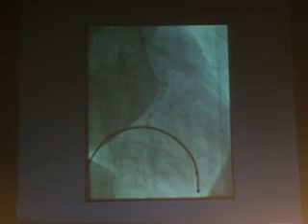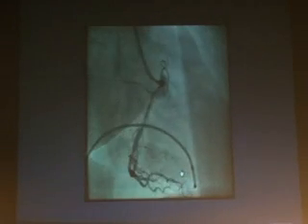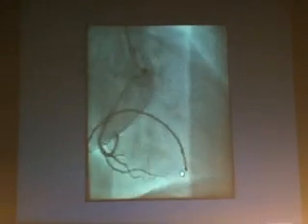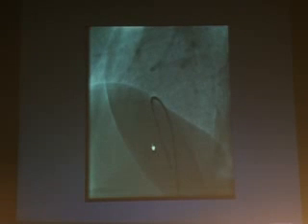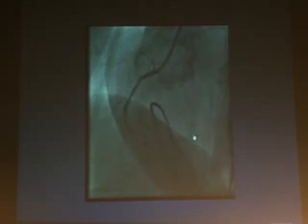This is a 65-year-old lady who had double vessel disease, with a discrete lesion in the circumflex and a lesion in the RCA. As you can see here in this angiogram, the RCA lesion is calcified. It's a long calcific disease, and there is a significant disease just where the pacing lead is crossing the right coronary artery. You can see the tightest spot. You can see it in the other view also, that there is calcium starting from proximal to mid segment.